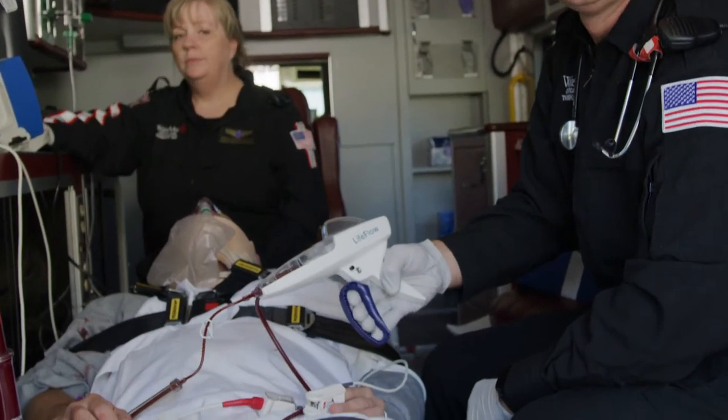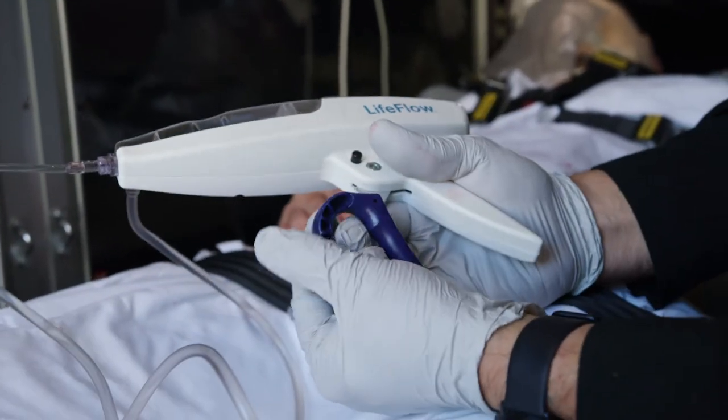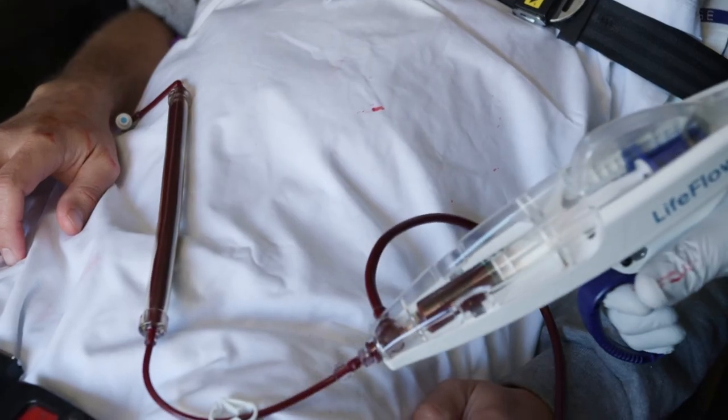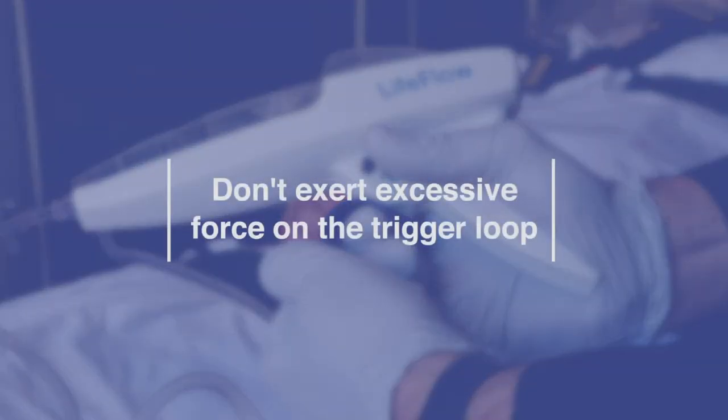The trigger loop provides a tactile feel and is designed to break away if excessive force is applied — this is a safety feature. If you notice a change in resistance or it becomes hard to squeeze, don't exert excessive force on the trigger loop.